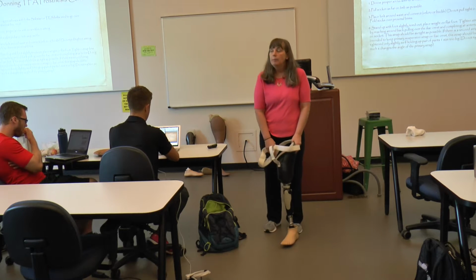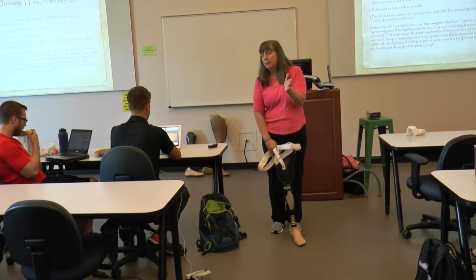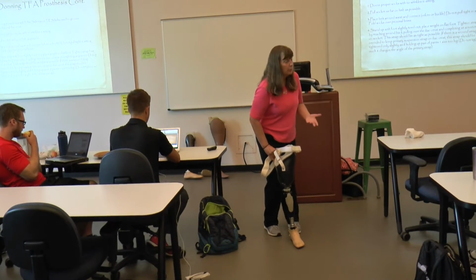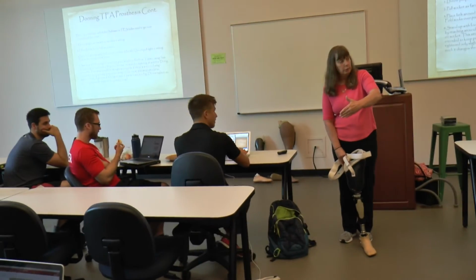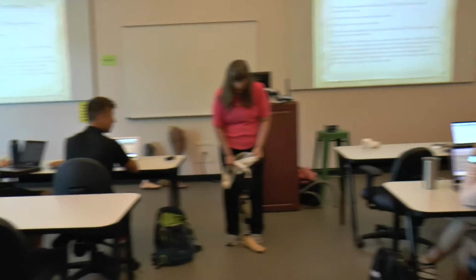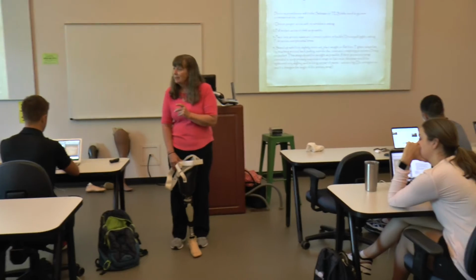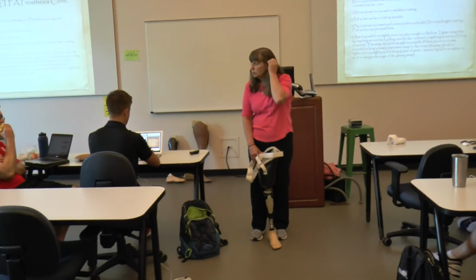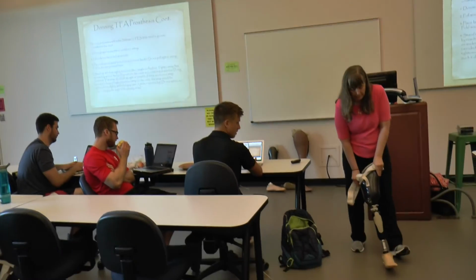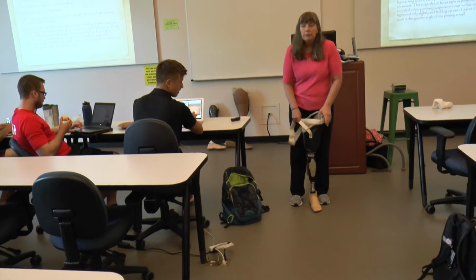I stand up. I make sure that my hips, my ASIS, are facing forward, or as I tell my patients, the headlights. Don't let those be back when I sink down into it, because when I go to walk, I will be internally rotated. So my ASIS are facing forward, the prosthesis is slightly toed out, and the knee is slightly out. Remember, we tell the patient that, because otherwise they may think it should be facing forward. I put weight on the prosthesis on a flat foot, not on the heel, and try to tighten it. I need to keep weight on a flat foot so it won't rotate.